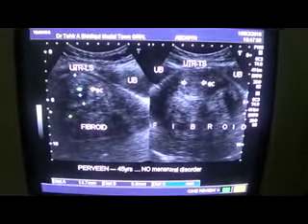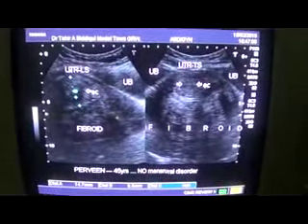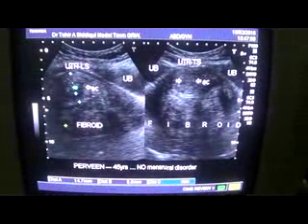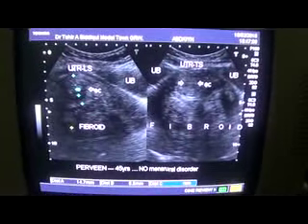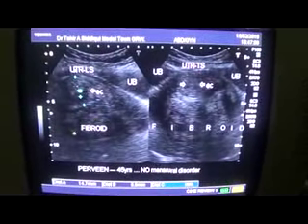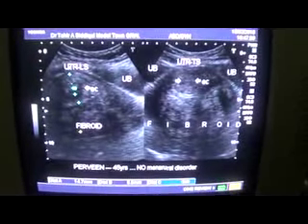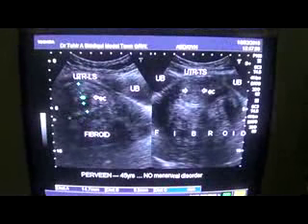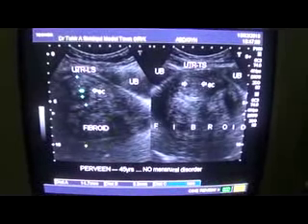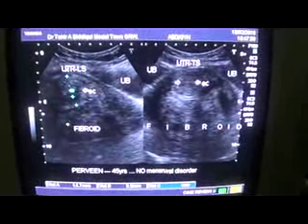The reason being that there is a large fibroid. This is the fibroid. This area is all fibroid, having a heterogeneous appearance, mixed cystic and solid, and there are a few cystic areas of degeneration and necrosis seen within this fibroid mass. In fact, it is a fibroid, and it relates to the posterior wall of the myometrium, and being large enough and protruding posteriorly, this fibroid is elevating the uterus.